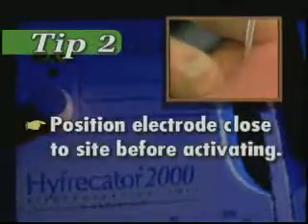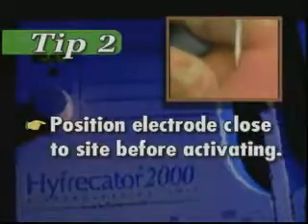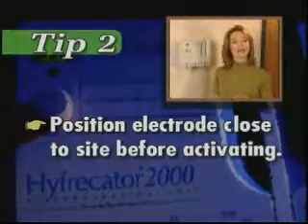Tip 2. When you're about to use the pencil, position the electrode close to the surgical site before activating. This will minimize the distance, or the electrical spark gap, between the electrode and the tissue, so the patient isn't surprised by a jolt.